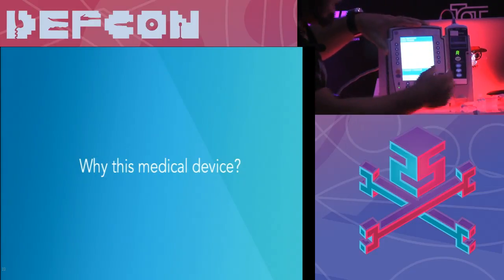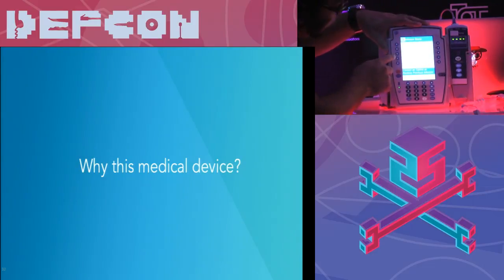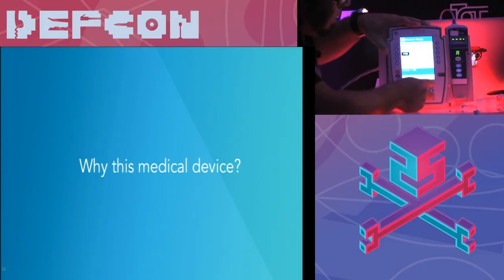But let's go to the example of an infusion. The person is going to come, click here, and say, okay, let's do a basic infusion. Here you put in, very important, the rate in milliliters per hour, and then the VTBI, which is the volume to be infused, the liquid to be infused. Just to do a quick test, let's say we put 50, and here we put a total of 200. And then we click start.